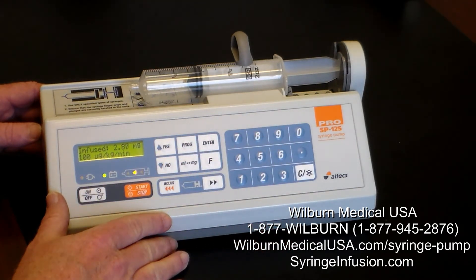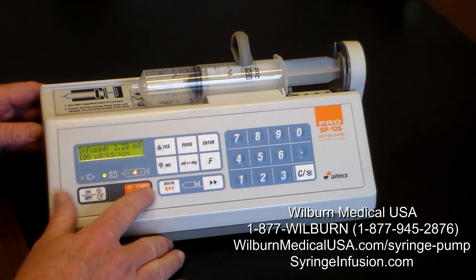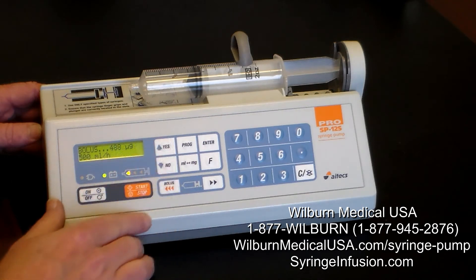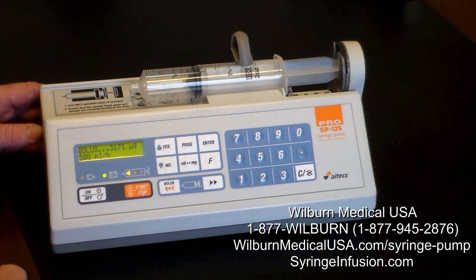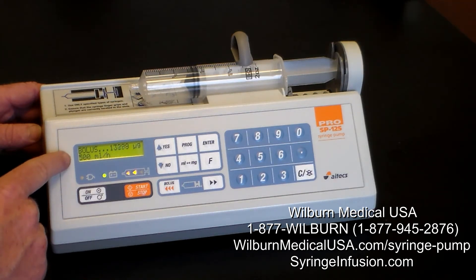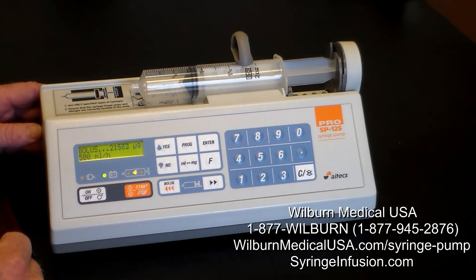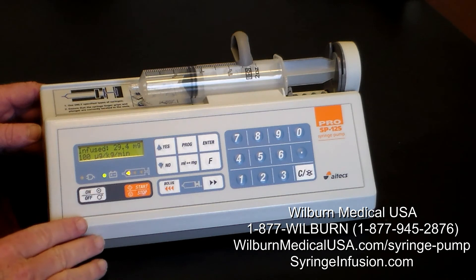Let's say I want to give a bolus dose during therapy. I press the bolus button and press yes. It's now going to give the programmed bolus value — set at 500 ml per hour, which many clinicians have agreed upon as a great rate for a bolus during therapy. After the bolus is given, it goes right back into the continuous rate.